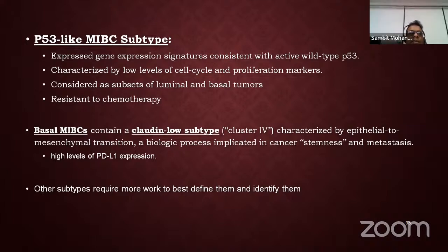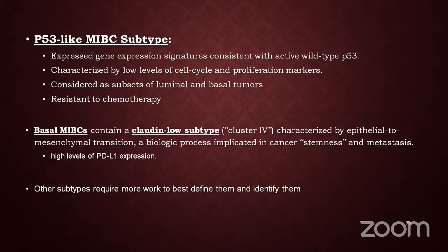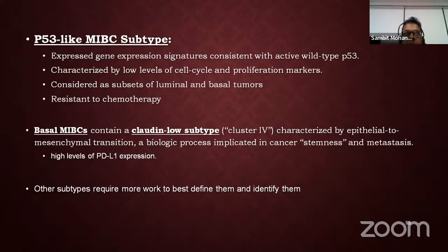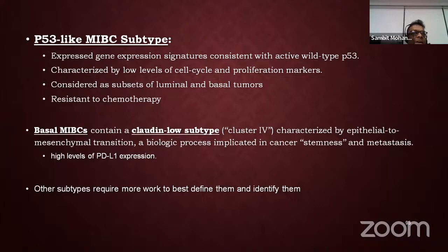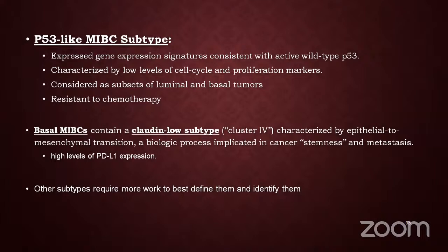You write urinary bladder, comma, transurethral resection, colon, new line. You write high-grade urothelial carcinoma, the first line. The second line would be lamina propria invasion is present. The third line would be muscularis propria is present, however, is not invaded by the tumor. And the pathologic T stage would be pT1. pT1, not A.